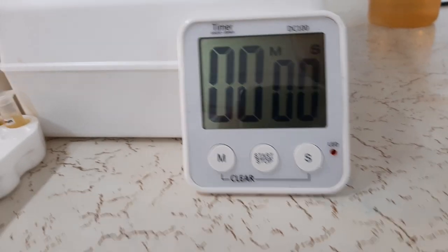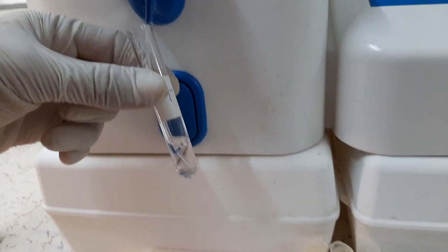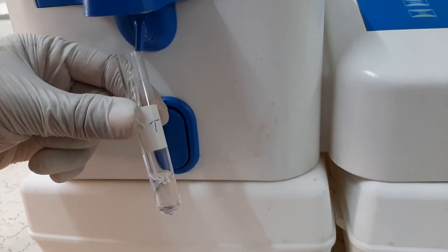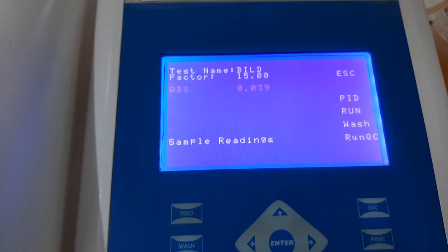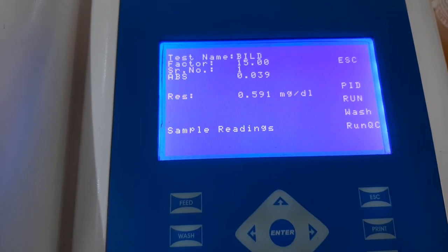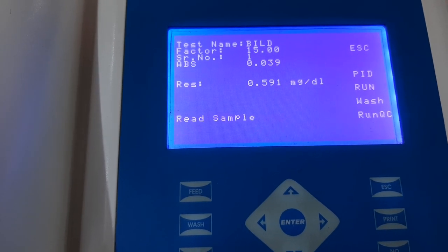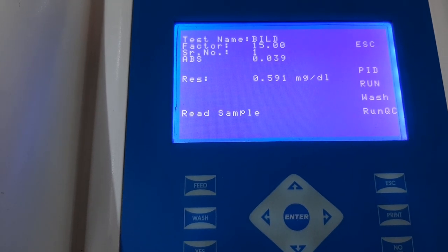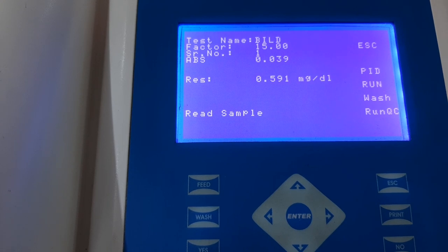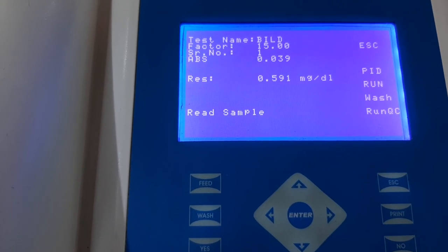After the incubation is complete, we will directly take the tube of the test and aspirate it into the instrument and take the absorbance. After a small lag time, the instrument will calculate the absorbance of the sample and also calculate the result of the sample. If you wish to run more patient samples, follow the exact same procedure. This is the correct way to perform the bilirubin direct test. Thank you and we hope this video has been helpful for you.